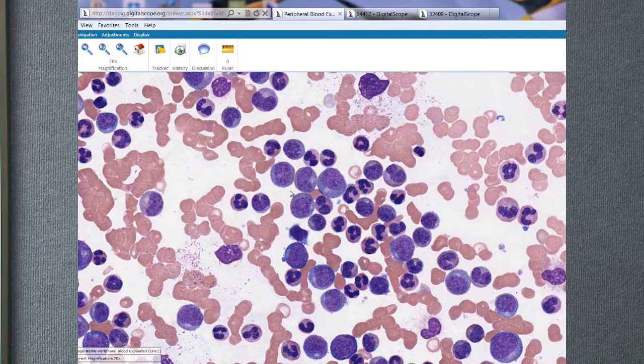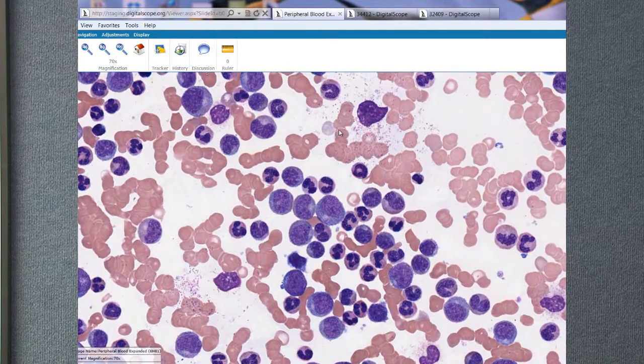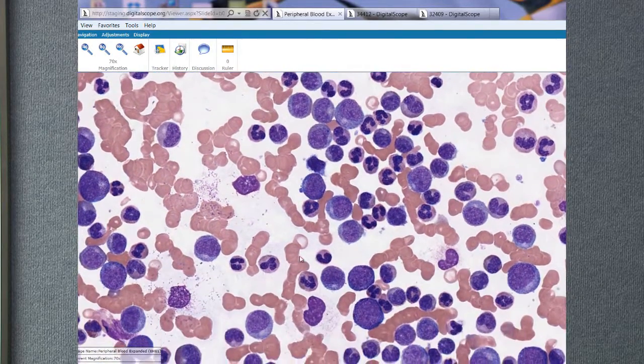Again, I don't know if you can see that this cell here is a little bluer than these. So this is the reticulocyte. These are erythrocytes, so these are the normal red blood cells. And this is the first one that's released, the blue one, and we'll come back to that one later on. So these are animal cells that we can see in normal blood and abnormal blood.